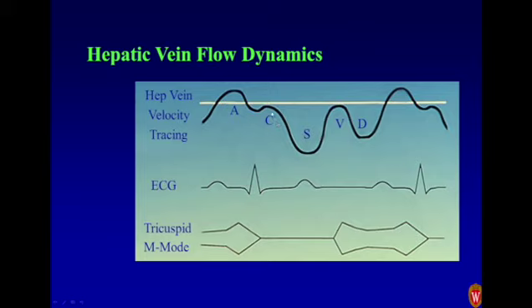Okay, so now we've got this empty right atrium, and flow just surges forward very briskly, accelerates, until you get to a point where finally it's starting to saturate and the velocities slow down. So this change from accelerating to decelerating velocity of antegrade flow is known as the S wave. And it's S because it occurs during ventricular systole. So the ventricle is contracted at that point.